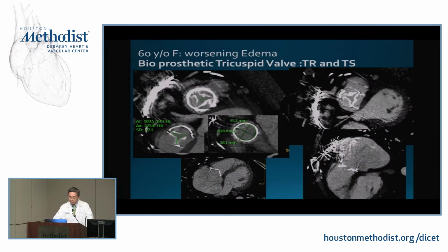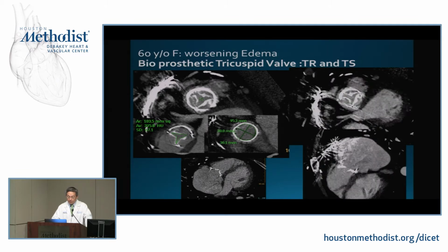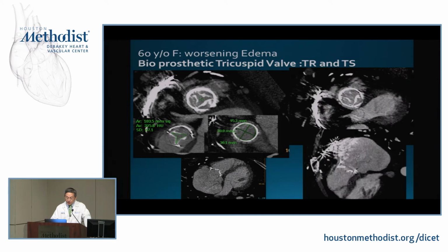It's a quick case of a patient with degenerated bioprosthetic tricuspid valve. As we can see there, it's both degenerative stenosis and regurgitating lesion. The leaflet doesn't close up, and you can planimetry, like in this case, very nicely, 1 centimeter squared.